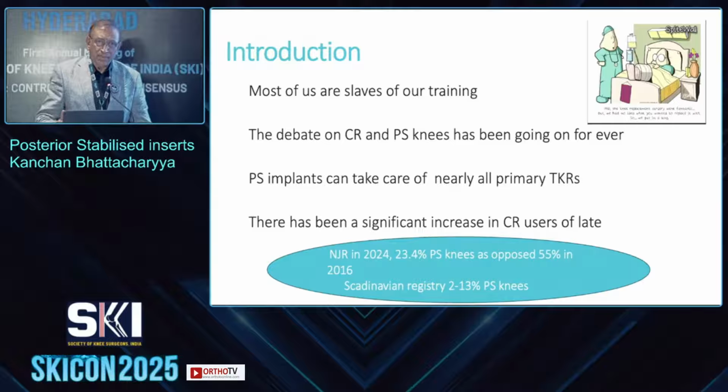Why occasional PS and why CR? For a committed PS surgeon, it's a no-brainer that you can do a PS knee to all comers. All kinds of deformities where you want to do a primary knee, you can fit in a good PS knee. And it will take care of almost all the deformities.